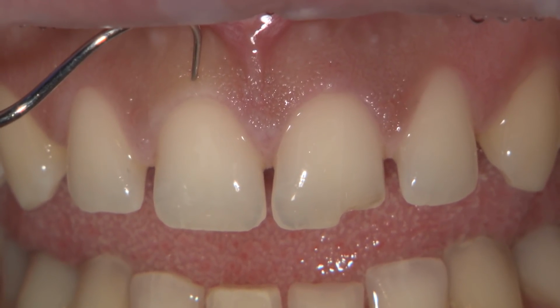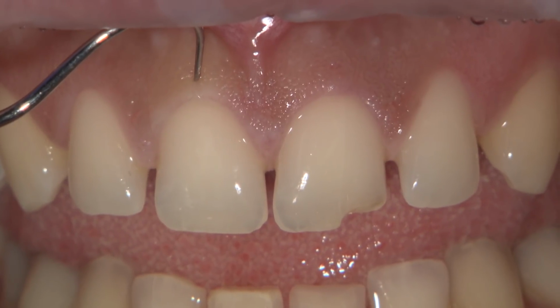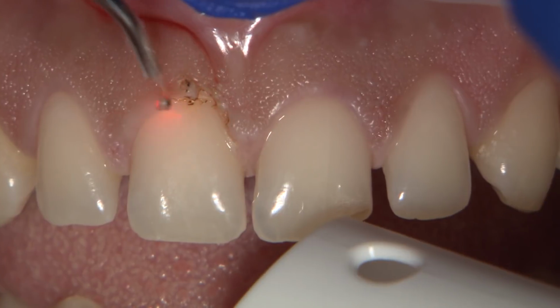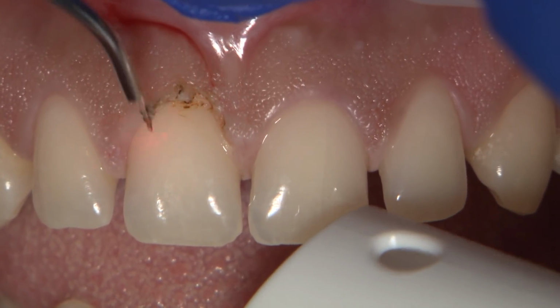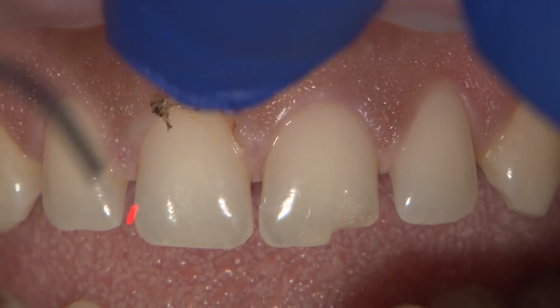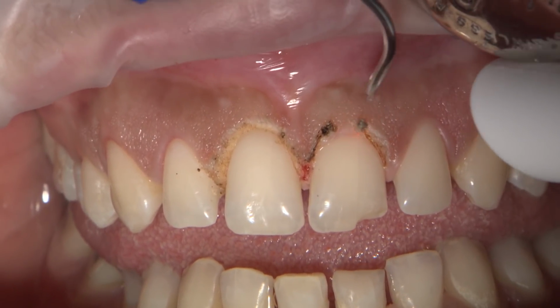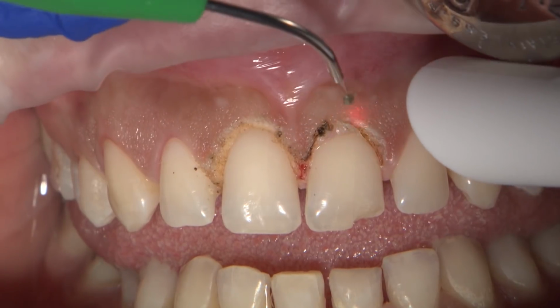We can see here that the gingival margins of the centrals are still lower than the laterals, so we can go ahead and recontour it. The correct position for the gingival margins was determined using tooth proportion beginning at the reference of the correct incisal edge location. The information was transferred to a model and another snap-on trial smile was created to show the patient the ideal result. Patient was asked to return in 6 weeks.